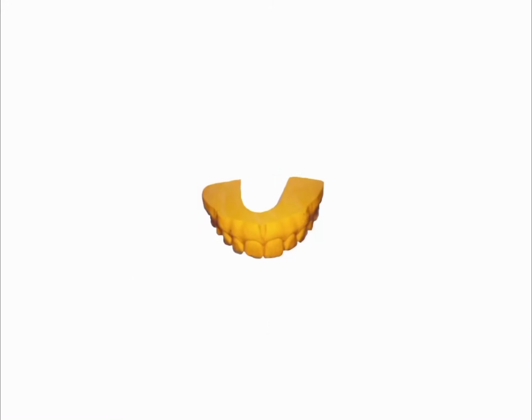Process of die preparation. After getting this cast, we need to mark holes for placing our die pin. Die is made so we can remove the tooth structure and work on it outside the cast. It helps us for better wax pattern preparation.